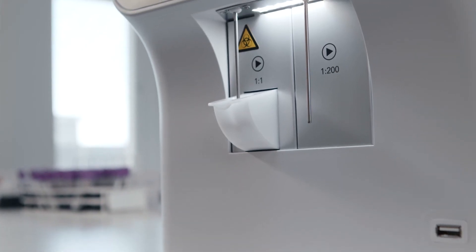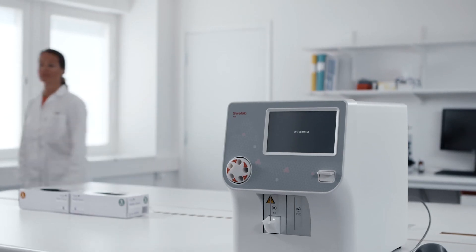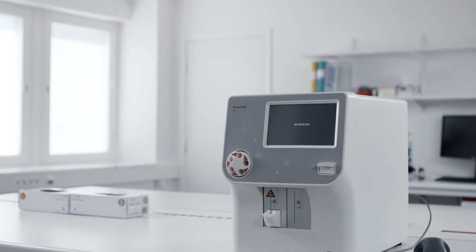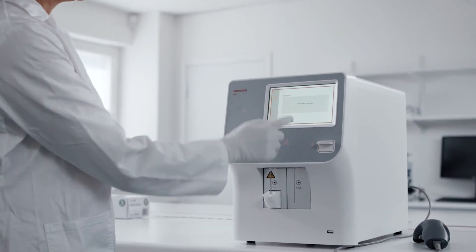Long, drawn-out start-up or shut-down procedures are avoided. You can leave the unit on without worry — it simply enters sleep mode and only needs a touch of the screen to instantly bring it back to life.